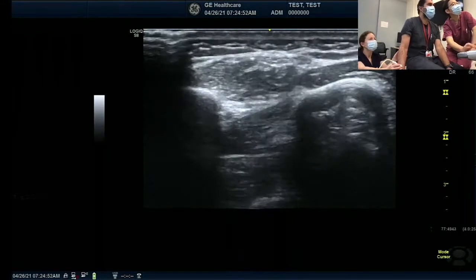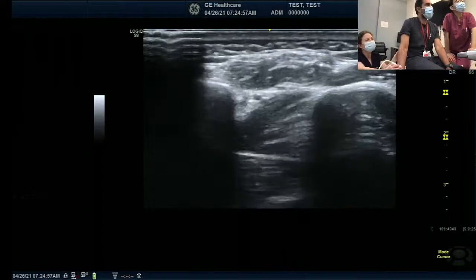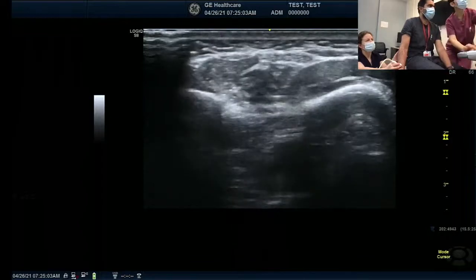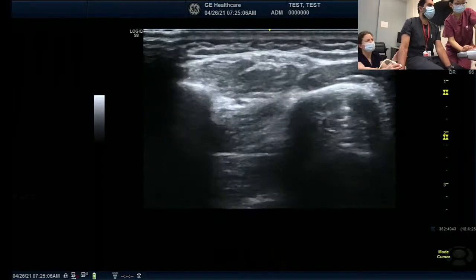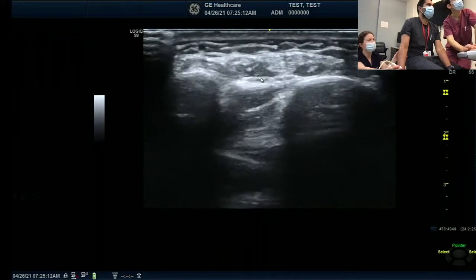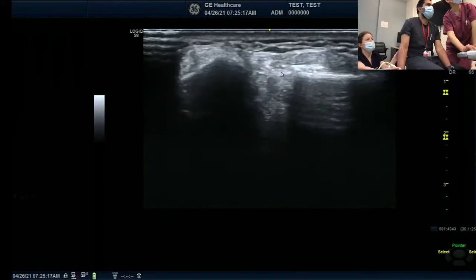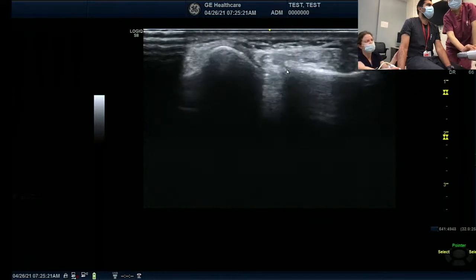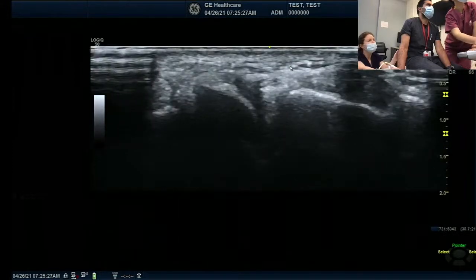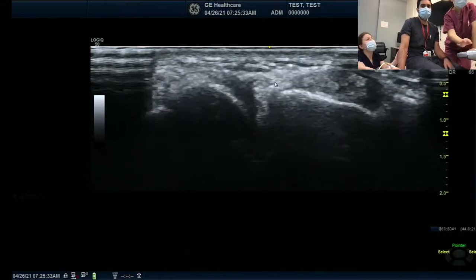Okay, let's continue down to the wrist. That's where I'm losing it. See here? Is it going more superficial afterwards? Yeah, now you're going to the tendon area. Okay, perfect. I think that's where it is. Yep, it's in the artery, I see. Oh, look at that. See, that's the fourth compartment. Stay there, or let me just move the depth. Here, I think we're going to see it. This is the color flow.